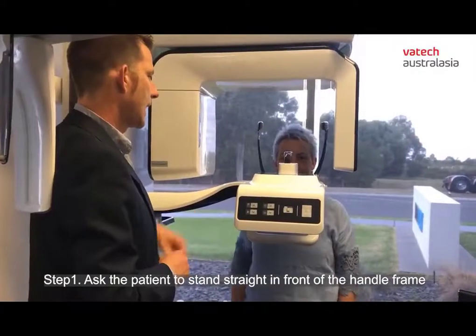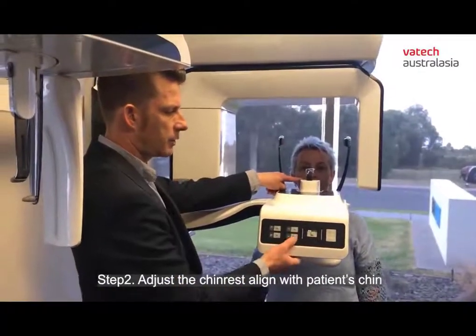Up straight and tall for me, and I'm going to get this in line with their chin, so I'm going up or down.